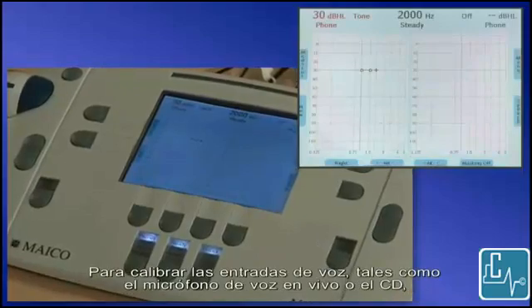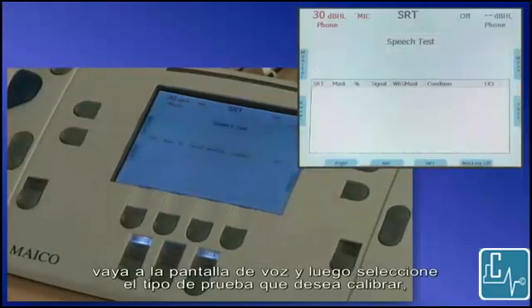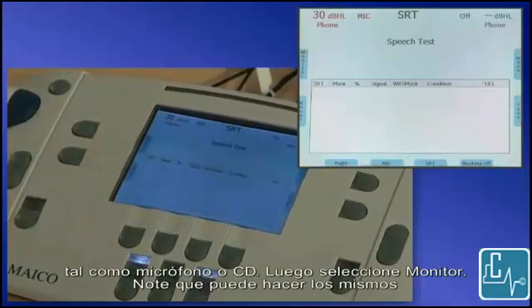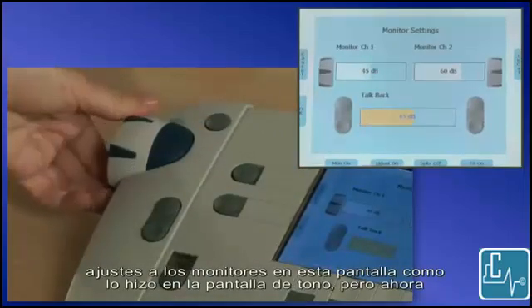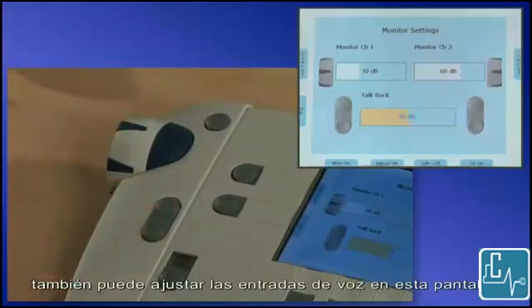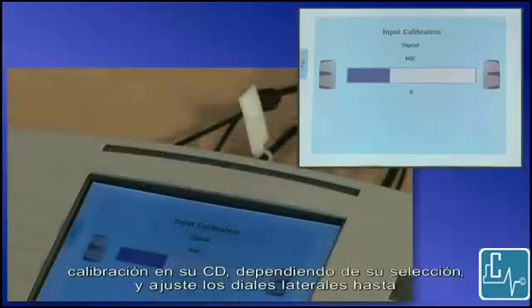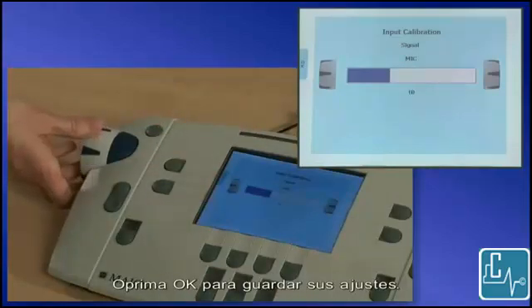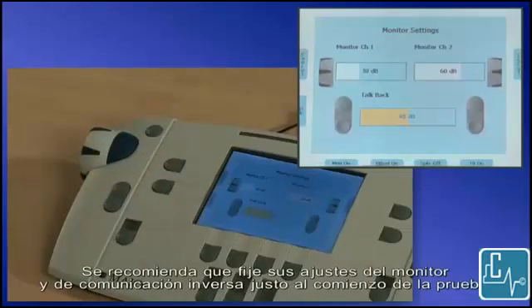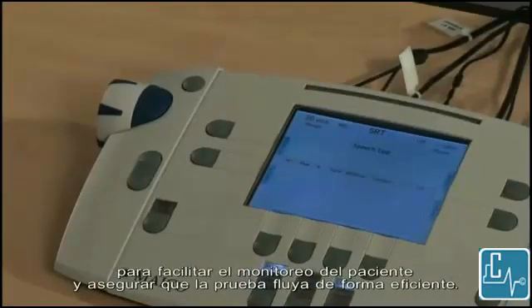To calibrate speech inputs such as live voice mic or CD, go to the speech screen. Then select the type of test you want to calibrate, such as mic or CD. Then select monitor. You can make the same adjustments to the monitors in this screen as you did from the tone screen, but now you can also adjust speech inputs from this screen as well. Select InCal to adjust the input calibration. Talk into the mic or play the cal tone on your CD, depending on your selection, and adjust the side dials until the VU meter shows green and is not peaking into red. Press OK to save your settings. It is recommended that you adjust your monitor and talkback settings at the very beginning of the test to ensure ease of monitoring the patient and an efficient flow of testing.